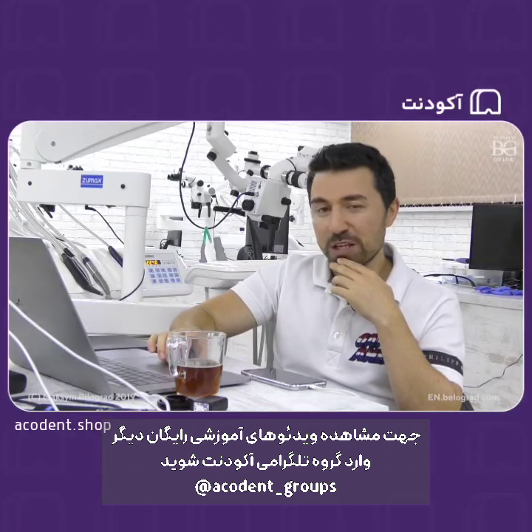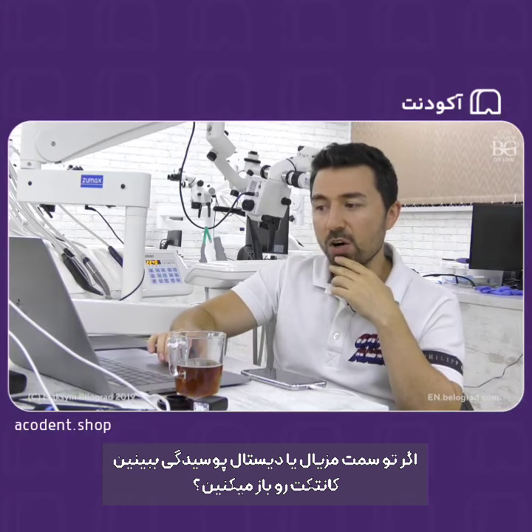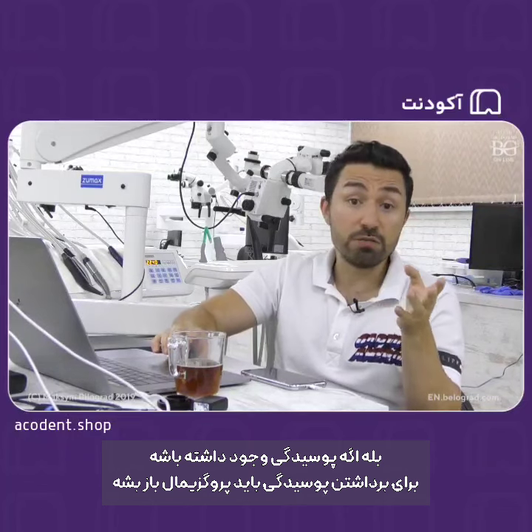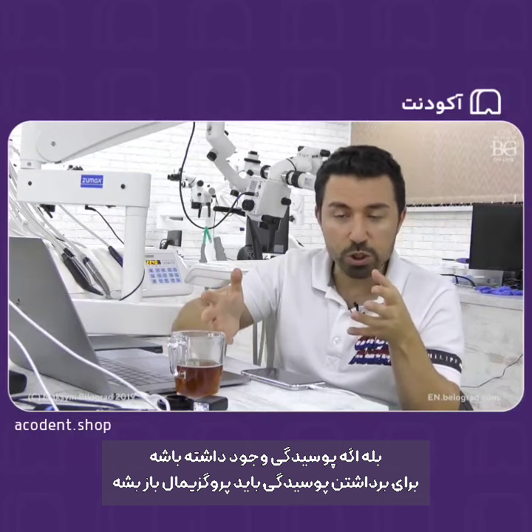Wow, working pretty intensively. Rajesh, do you open contacts if there is a cavity on the mesial or distal side? Yes. If there is a cavity, you open the proximal because you remove the cavity.